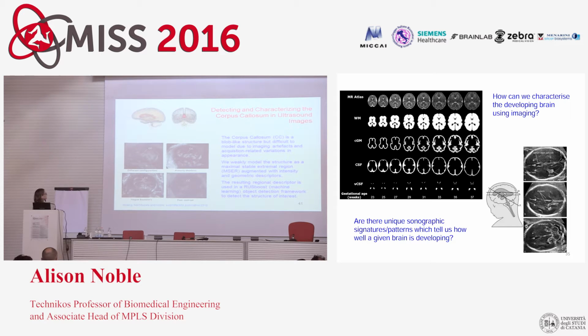But the other reason to work with Peter was to think about what's the relationship between shape of faces in the fetus and also the underlying neurological changes. And one of the key structures that is of interest in the developing brain that's certainly related to fetal alcohol syndrome is the corpus callosum. And so what we've started to do, again, thinking about machine learning-based approaches, is to try and extract shape features. Now try to extract the corpus callosum.